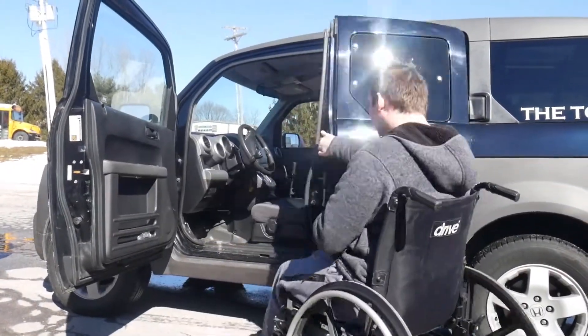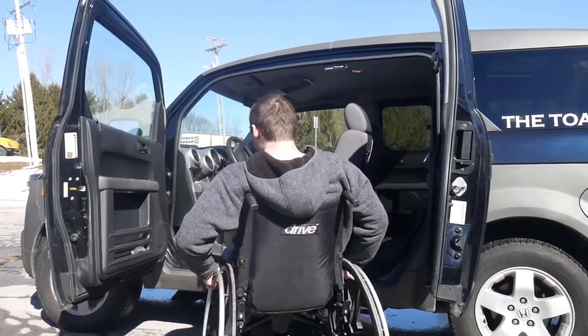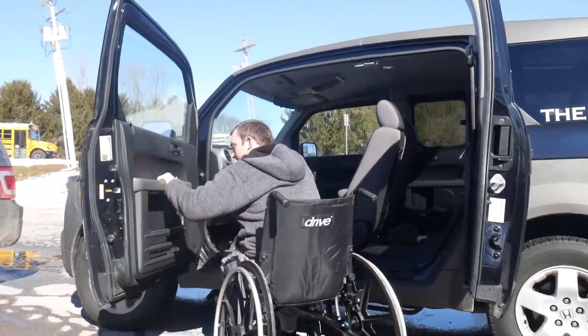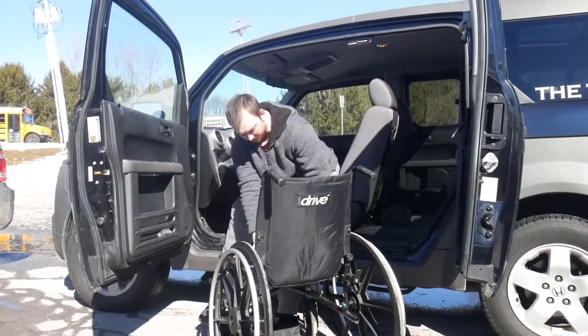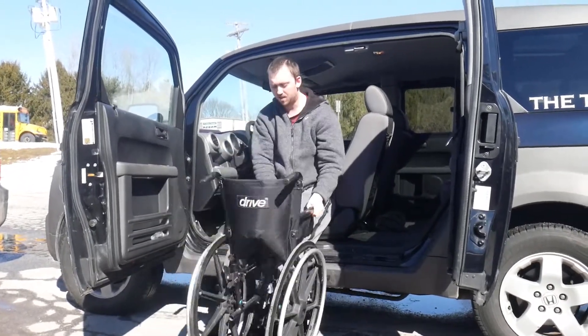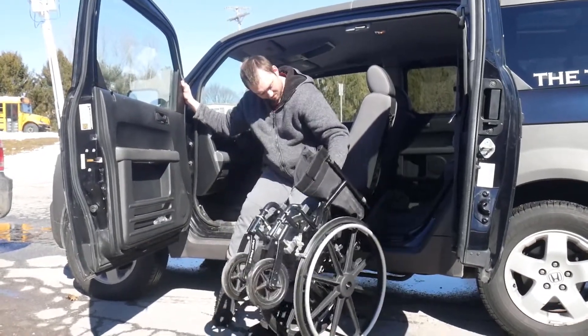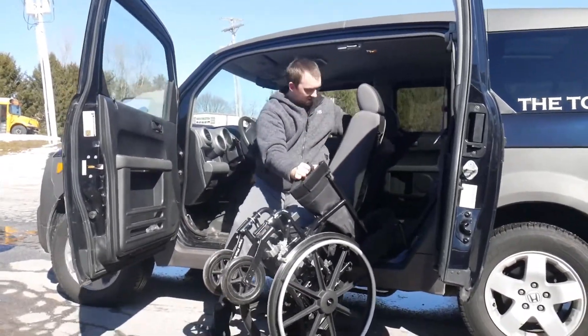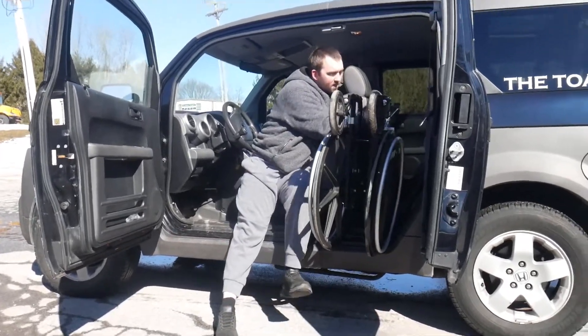We're going to start off by showing how I get into my car. My legs do work so I can stand up — I pretty much just have no balance. So I stand up, get into the seat, wrap my arm around like that, and pull in the wheelchair.